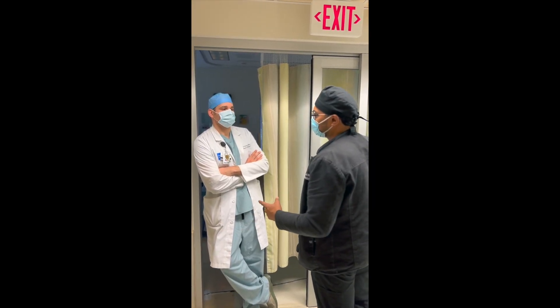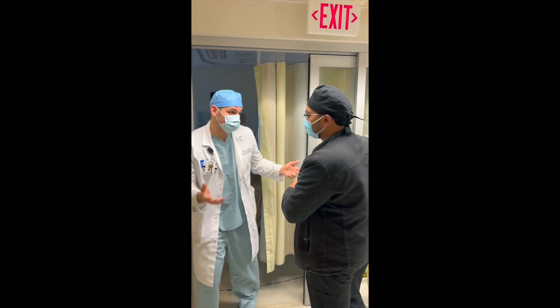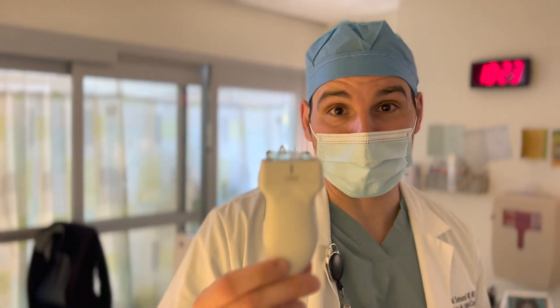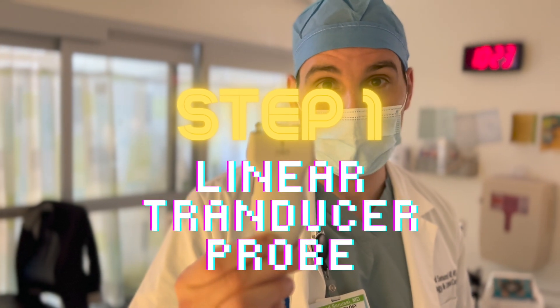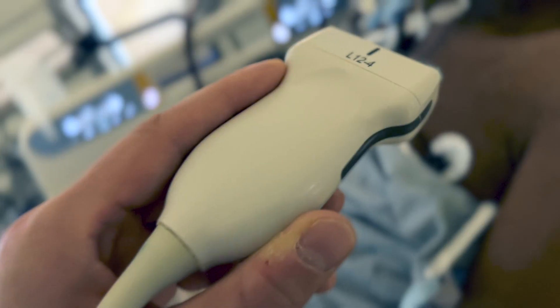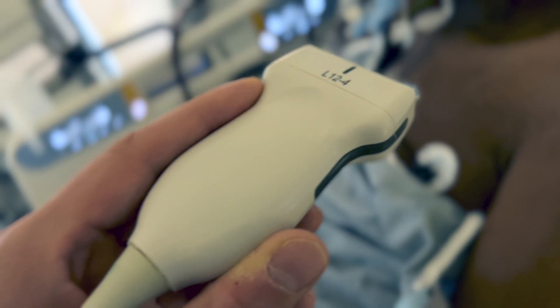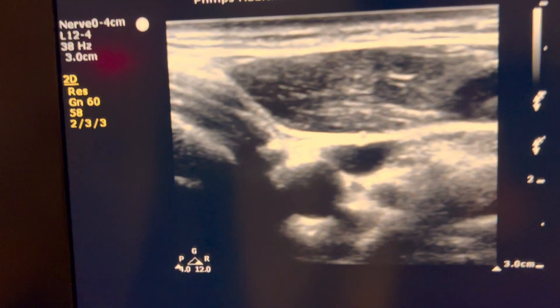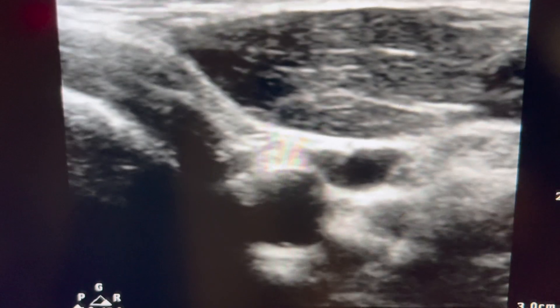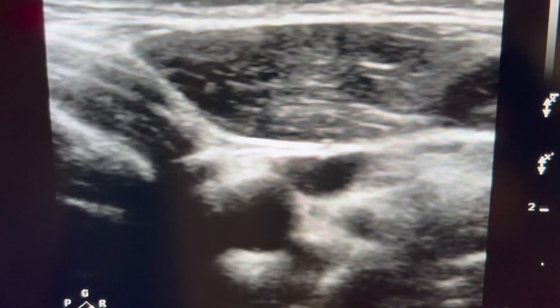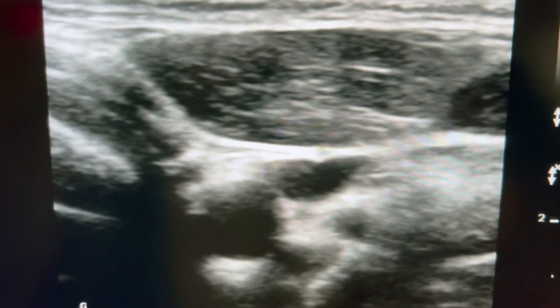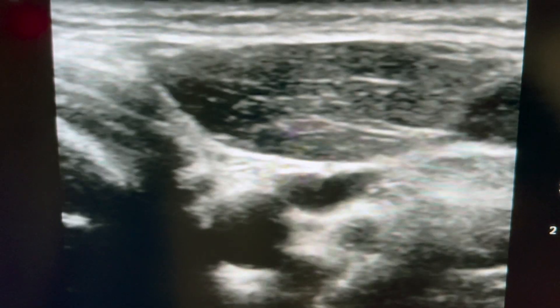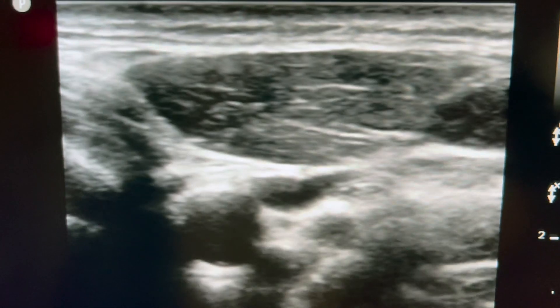It's easy, let me show you. It's very important to do your vascular survey — use your linear transducer probe to take a look at your artery and vein. Place the linear transducer probe onto the neck. Step one is to do a vascular survey; you can clearly see two anechoic structures in the middle of the screen. These represent vessels — one can be a vein, one can be an artery.